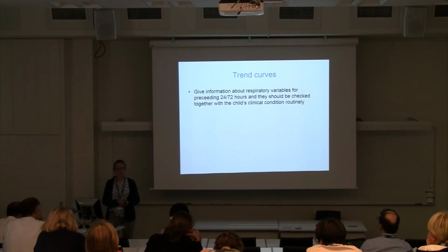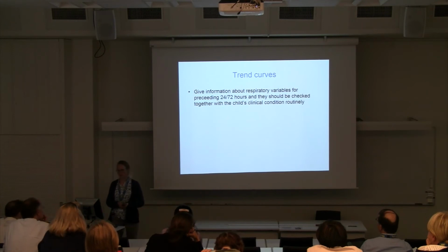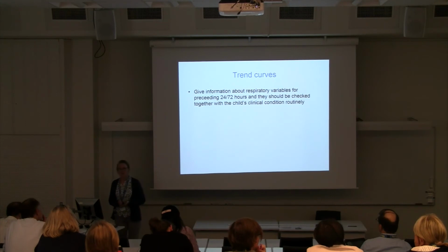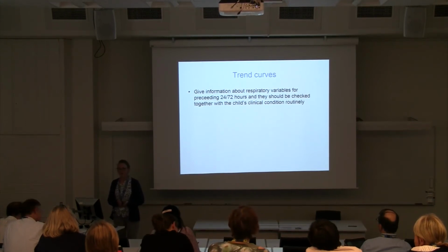So what is new in NAVA ventilation is these very valuable trend curves that give information about the respiratory variables for the preceding 24 hours in the Servo-i and 72 hours in the Servo-n ventilator. And they should be checked regularly.